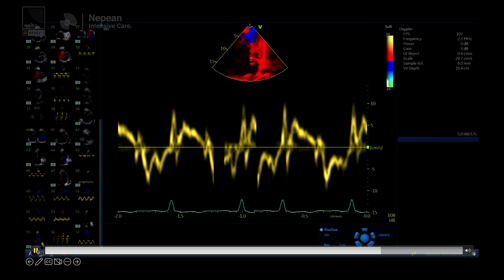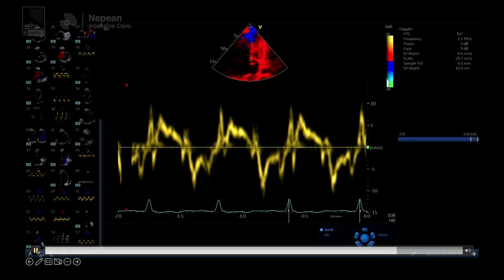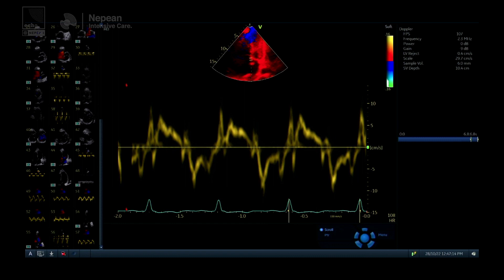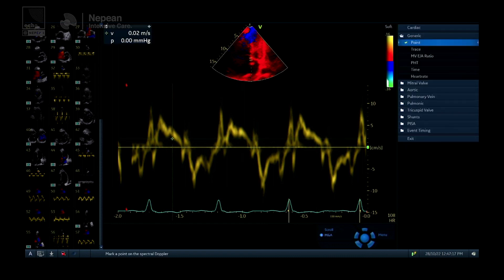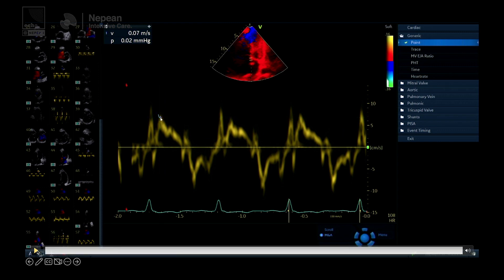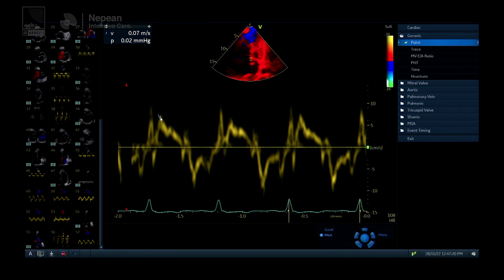That's a really important tip because when people are starting out with Doppler they often make these erroneous measurements. The other thing to say is that with any spectral Doppler, if you have the gain too high you'll get fuzziness around the edges, which can lead to a much higher measurement.